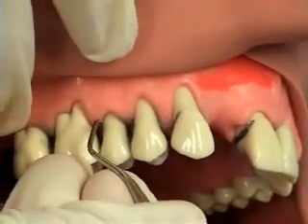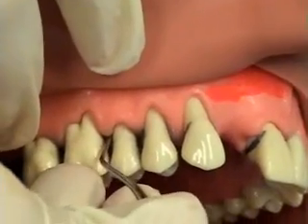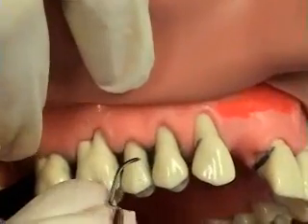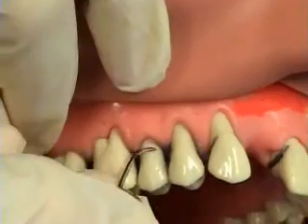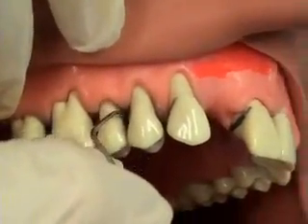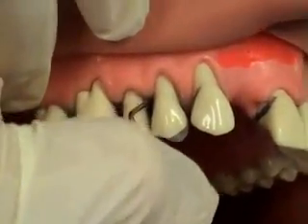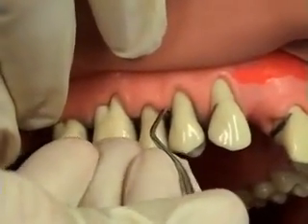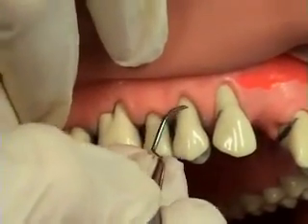Keep in mind this instrument has a thicker shank, more rigid, with a thicker working end — so it's for moderate to heavier calculus with retractable tissue. The posterior teeth are scaled from the distal line angle into the distal, and then the clinician starts again at the distal line angle and rolls the instrument into the mesial. Notice how she uses the same working end but opposite cutting edges — one cutting edge for the distal, the instrument is turned, and the opposite cutting edge on the same end works into the mesial.